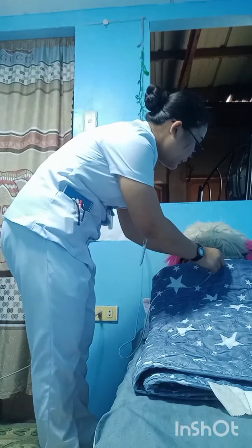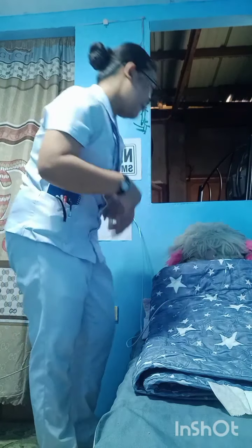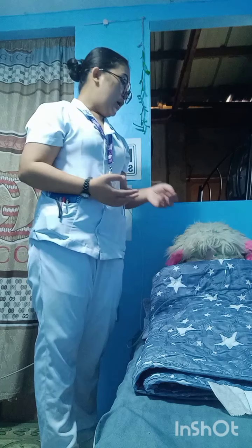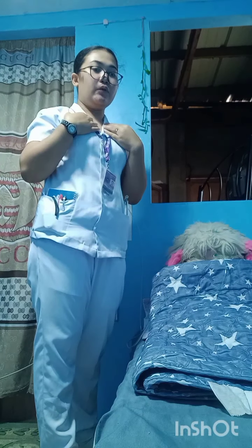Like this. So, sa pagpad naman, hindi naman siya required or kumbaga, hindi naman siya kailangan lalo na kung stable naman yung pagkakalagay ng ating cannula o yung tubing dito sa ating ears tsaka dito sa ating cheekbone.